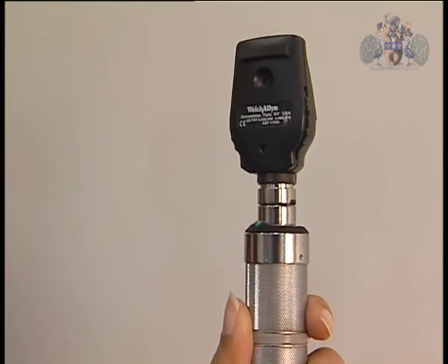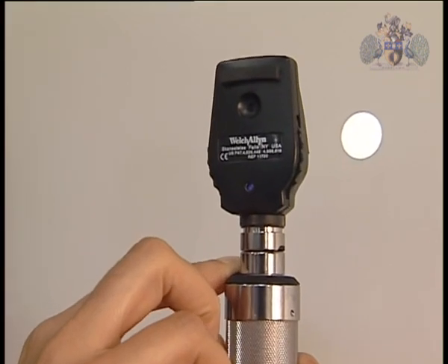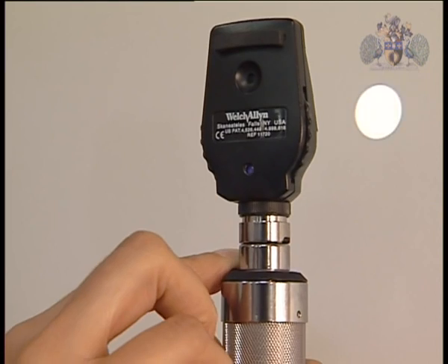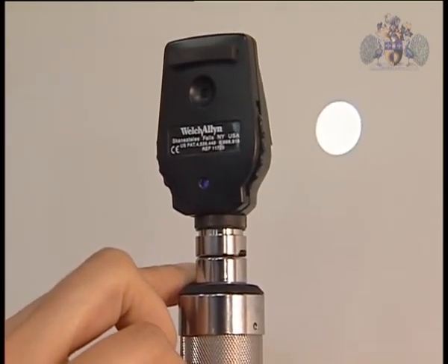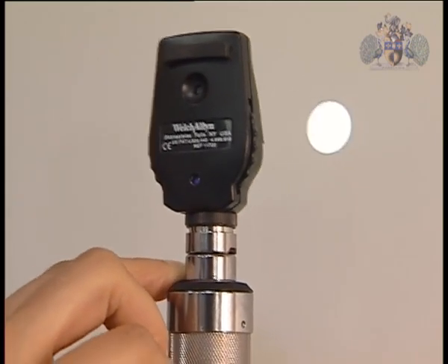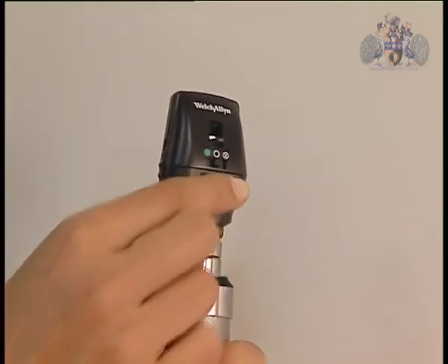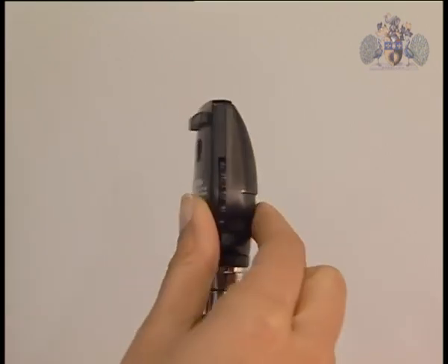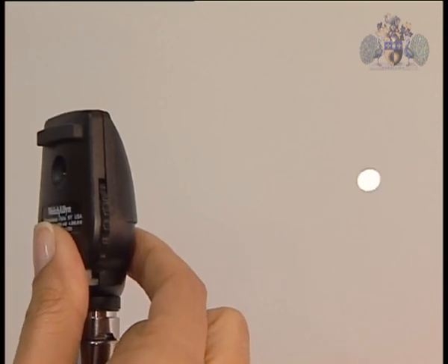Turning the ophthalmoscope on. Press the green button and rotate the shoulder to turn the light on. You can adjust the brightness by moving the dial further forwards. There is a switch at the back which will adjust the type of light beam you get.